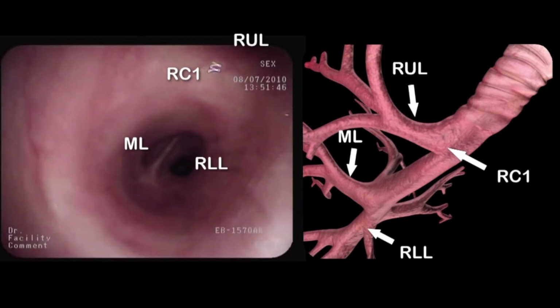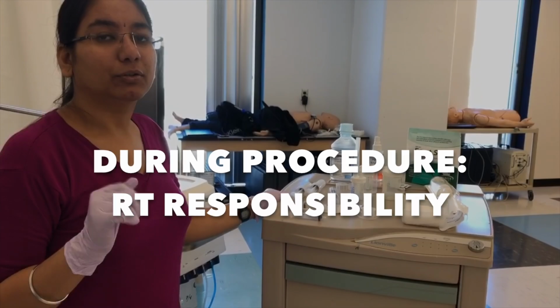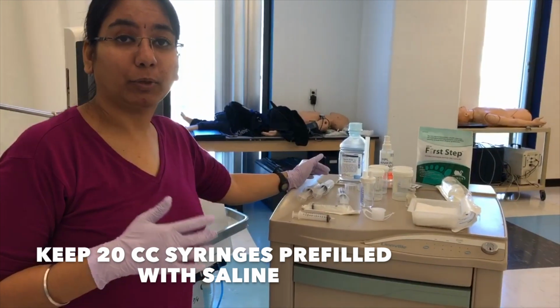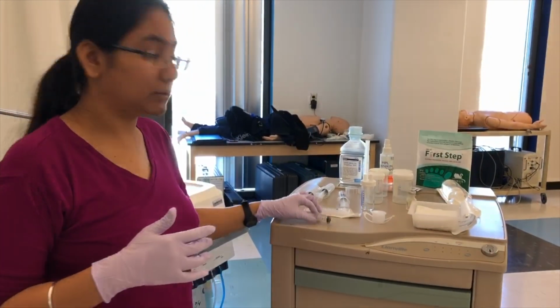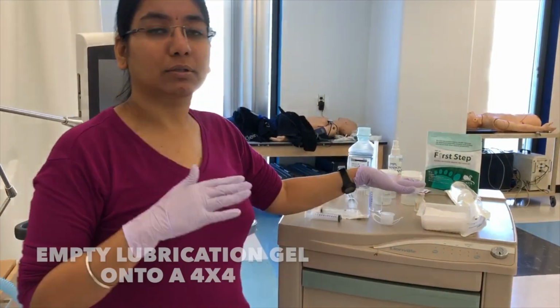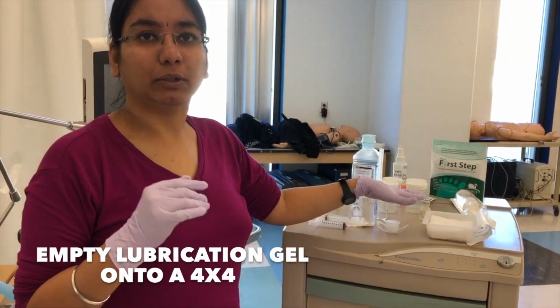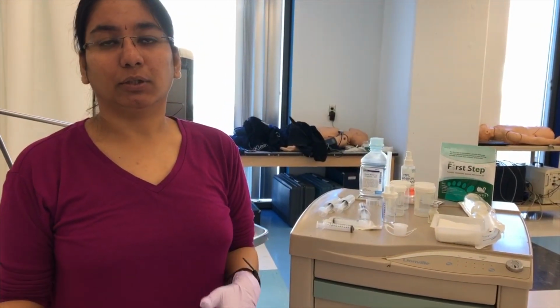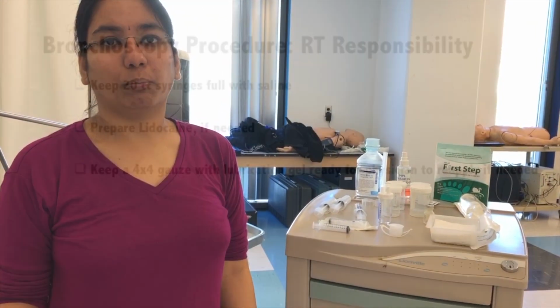So now that we've seen the respiratory tract, let's go to Saranya to talk about the respiratory therapist's responsibility during the procedure. So during the procedure, make sure that the 20 cc syringe is always pre-filled with the saline, and the 10 cc syringe is pre-filled with the drug, and the 4x4 is lubricated with a lubricating gel, so that if in need we can use them on the scope.